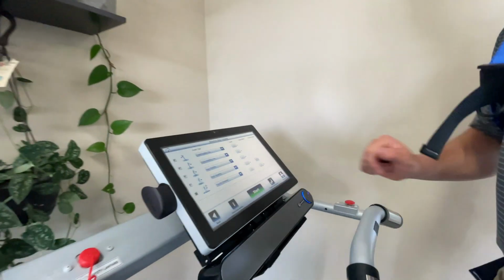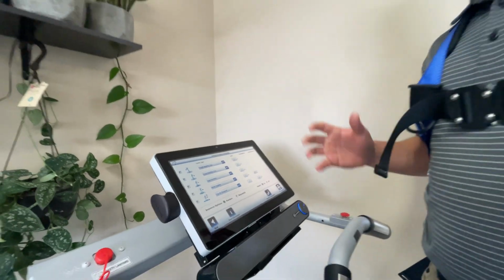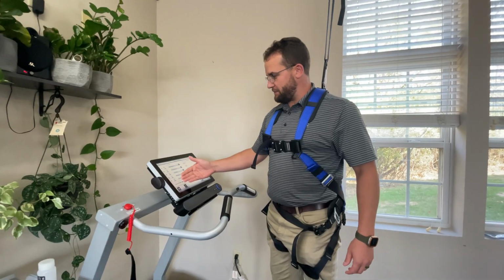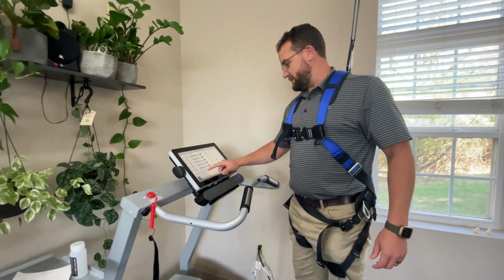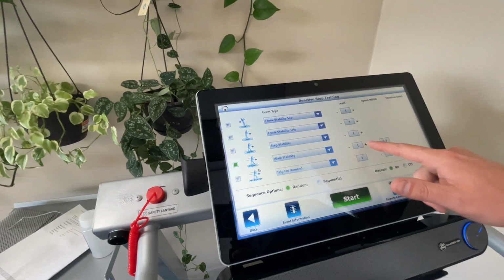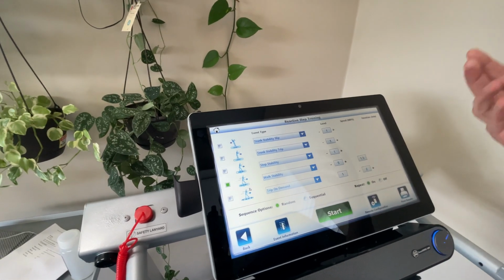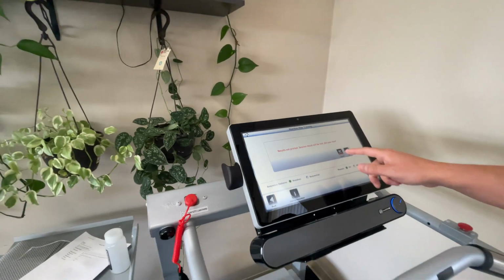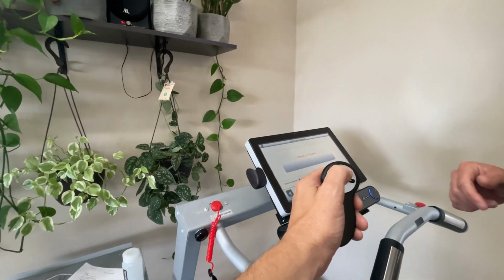Let's go ahead and hit stop. Excellent. Okay, so the next one we're going to do is the 5 slips, and the little images are here, but we can do a little walk stability. So if we just simply select walk stability, it has 5 levels, 1 through 5. So 1 being the most subtle, 5 being the highest level. So what we're going to do is, okay, and then Tony can hit the start button again.